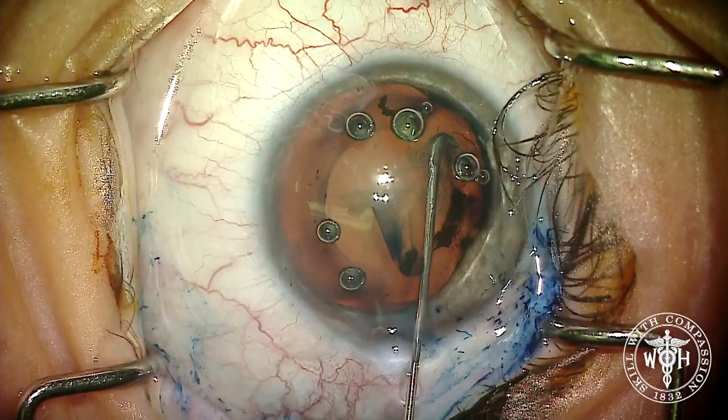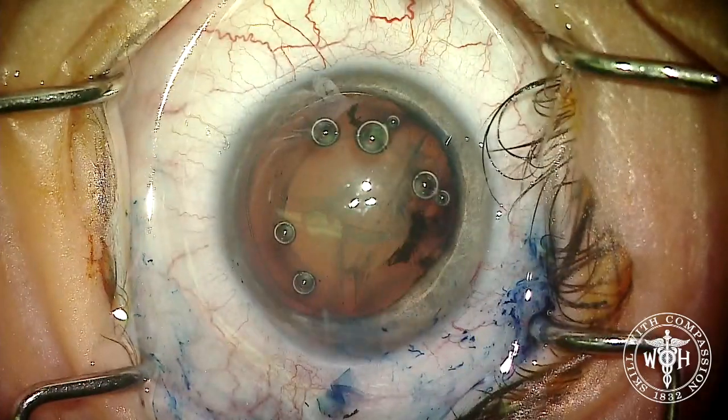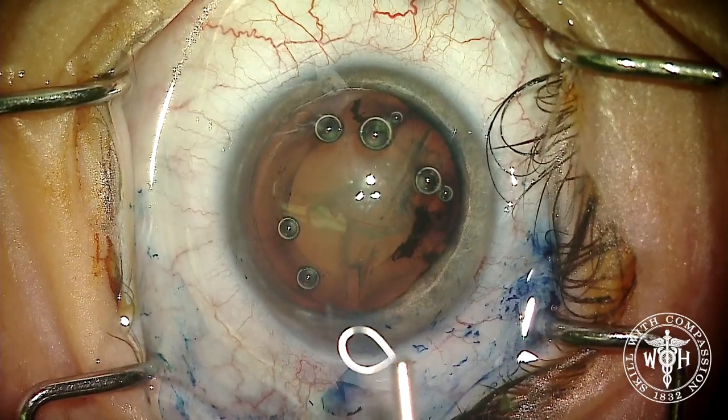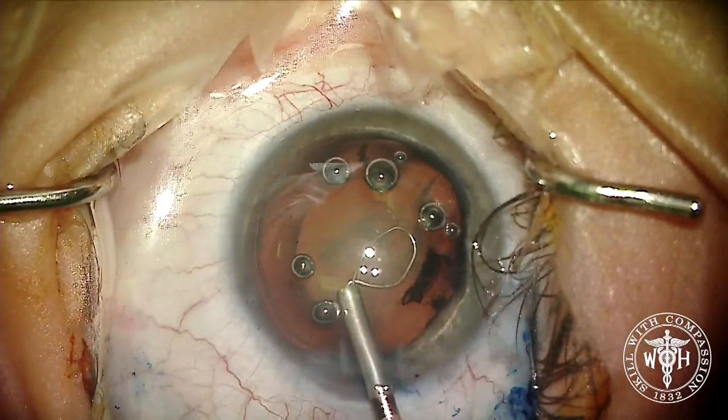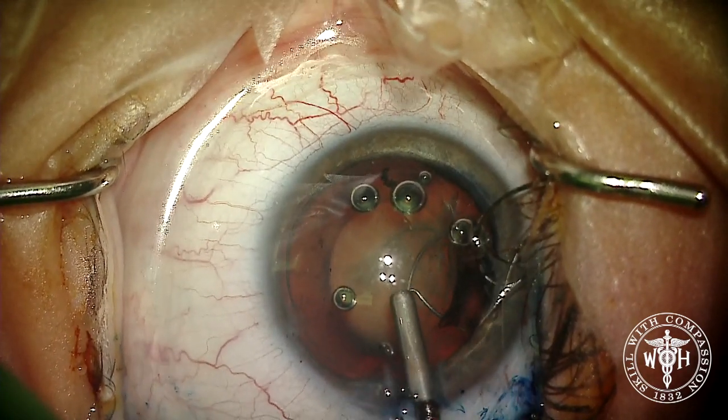The mission here was to try not to disrupt the DMEK, knowing it's already relatively low in cell count. We're going to use the MyLoop device — a small nitinol loop that you can use to snare the lens and essentially divide it without using any phacoemulsification at all.